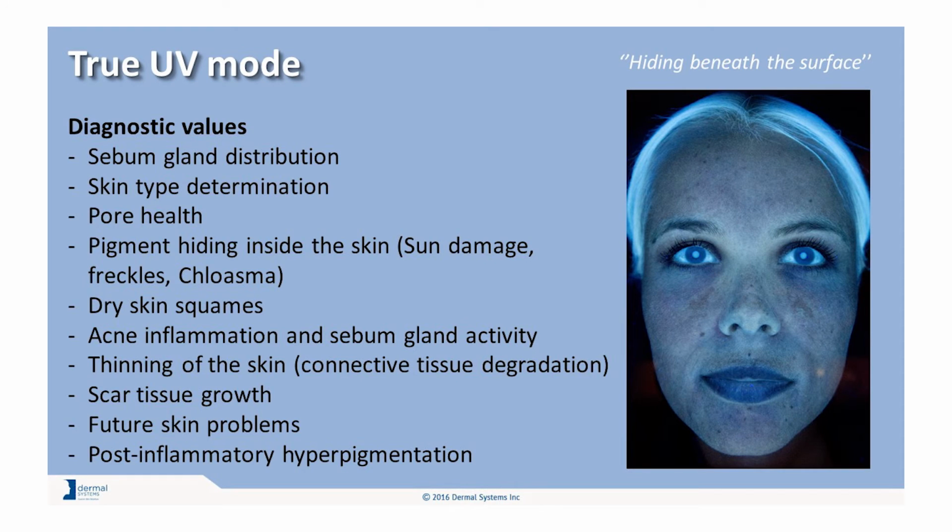The Woods mode is named after the inventor of the original Woods lamp, Robert William Wood. In this mode, the illumination of the Woods lamp is replicated.